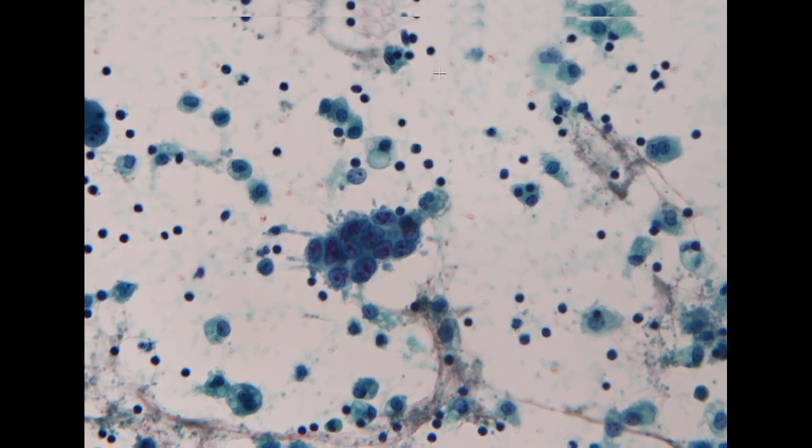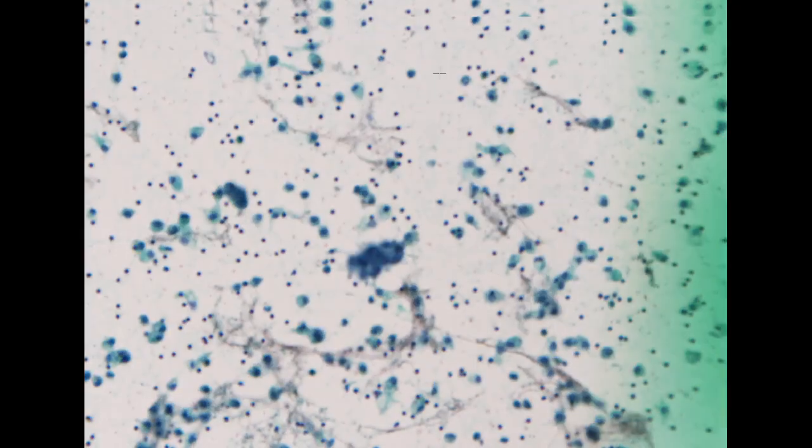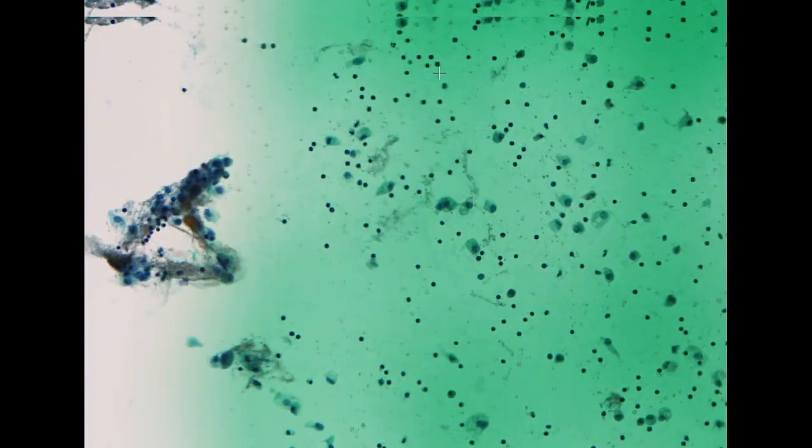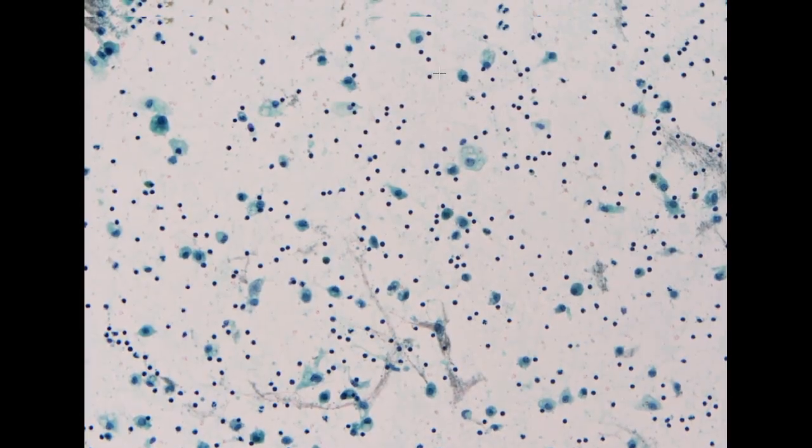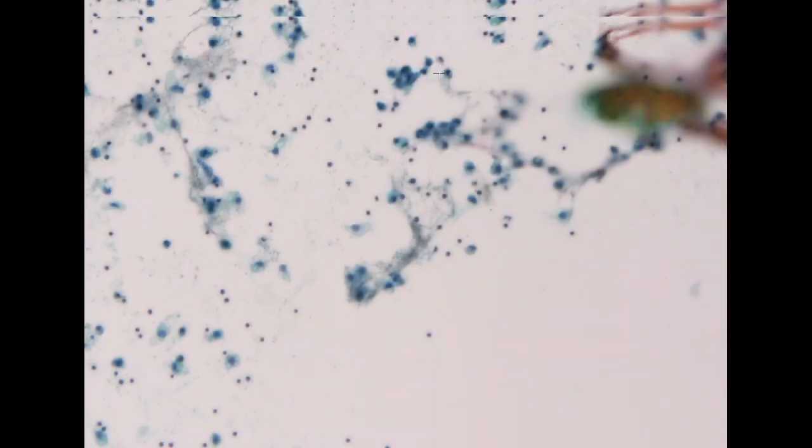Because again we have signed out the patient's prior pleural specimen as positive during the treatment, the cellularity of the tumor cells might be scant because it is maybe partially responding. So we will have very scant tumor cells.